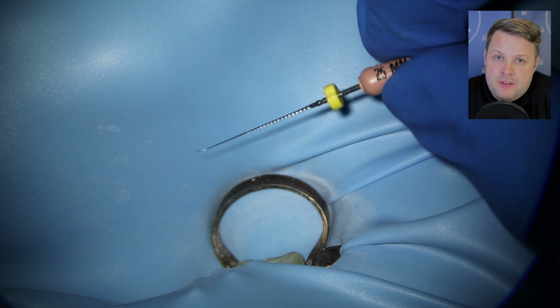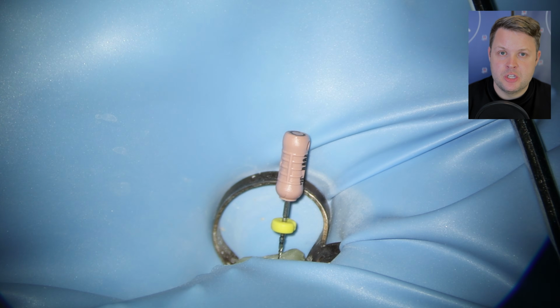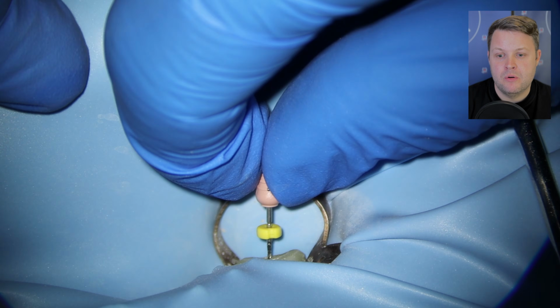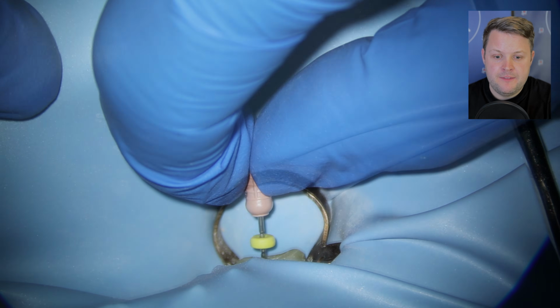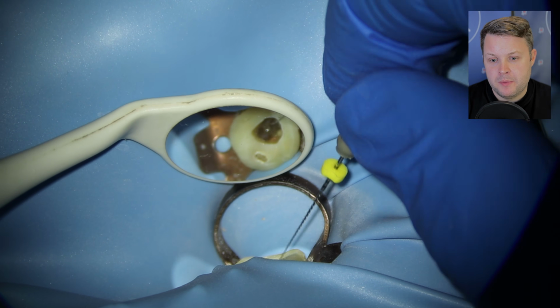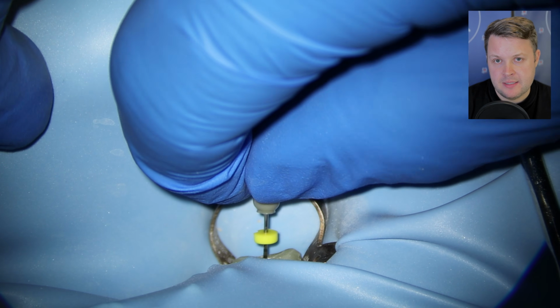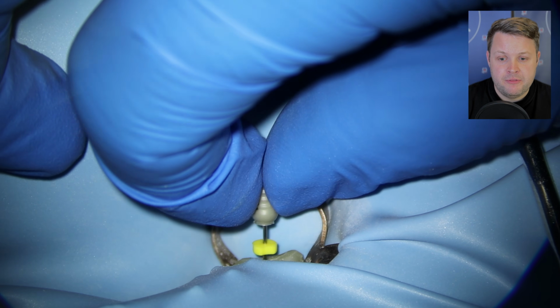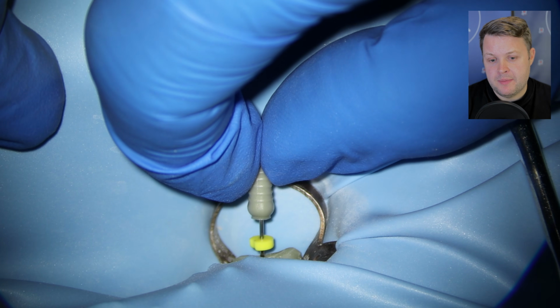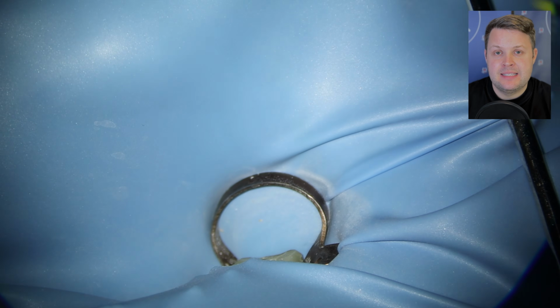Although these C+ files are quite stiff, I think these size 6 C+ files are just a bit too bendy to get past these tough anatomical difficulties. And then the very, very last forlorn hope, I'm going to use a size 8 to try and negotiate, and I just cannot get to the end. And it's at this point I'm thinking to myself, I could carry on, I could fracture a file, and this could just get me into more trouble. So we're going to say to ourselves, it's probably best that this is as far as we can get.